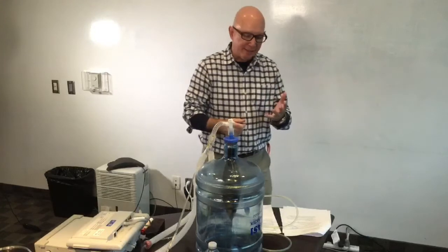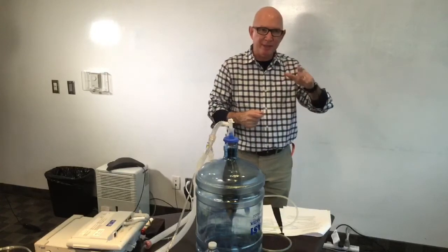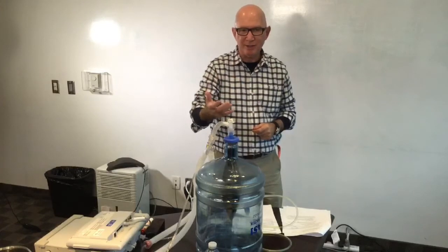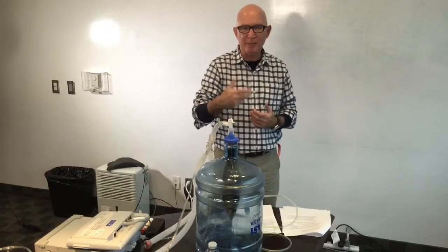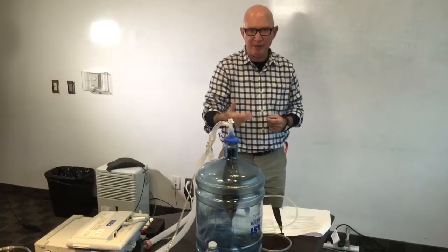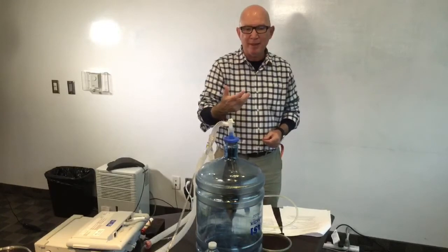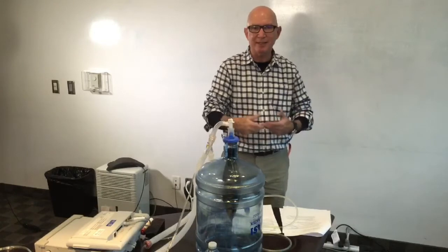The bottom line is that in our medical directives, again, we know that the limits for peak inspiratory pressure and plateau pressure are 30 centimeters of water. However, sometimes we have to exceed those limits based on a number of reasons. I think we all can appreciate that someone who's in an acute asthmatic attack who has to be intubated and ventilated is going to require peak inspiratory pressures much higher than 30 centimeters of water, and we'll accept that because that's what's required. Similarly, if you need high pressures to get a reasonable tidal volume into somebody, then so be it.